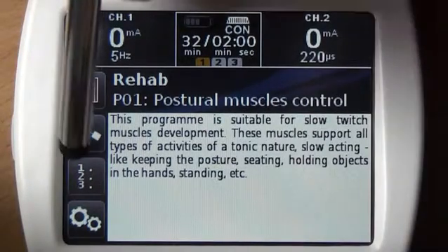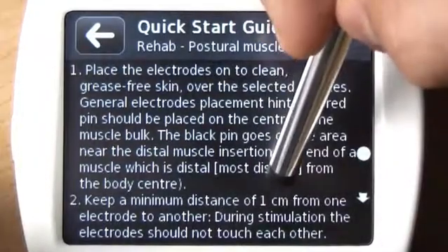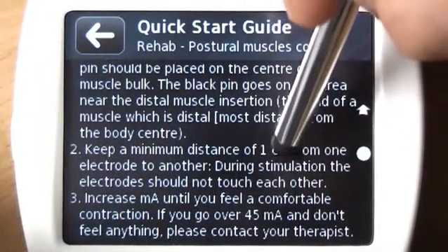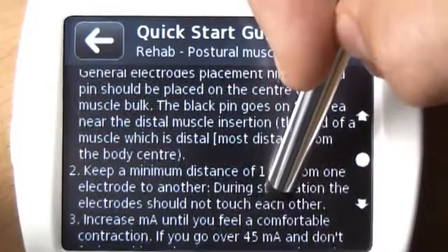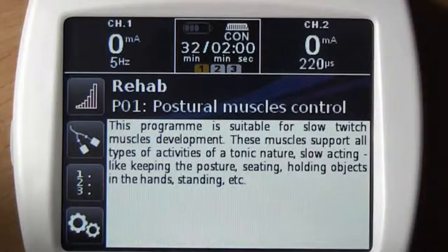Now press the 1, 2, 3 button to see the quick start guide for the selected program. It is important to read the guide before you decide to use the program, especially the first time. The guide explains typical use and phases of treatment, step by step.